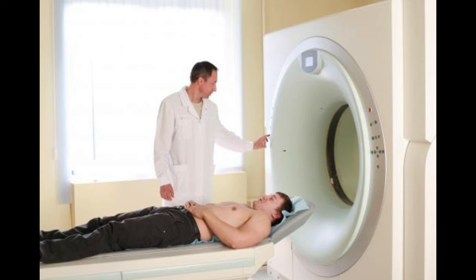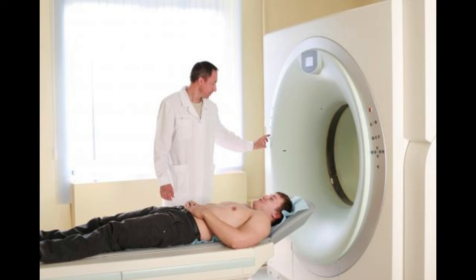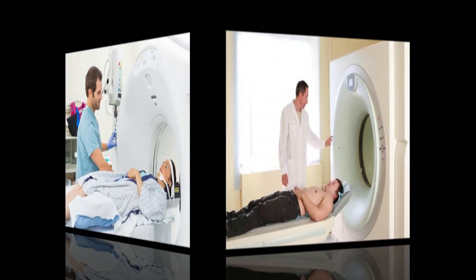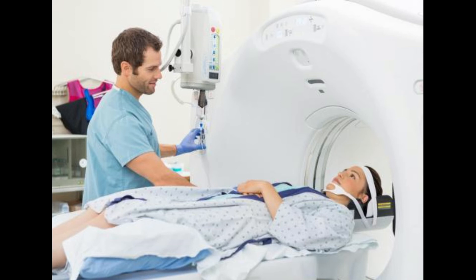These factors can include the location of the suspected cancer, the patient's history, and other imaging results. PET scan images can be combined with computed tomography, CT, images or magnetic resonance imaging, MRI, in a process called co-registration or image fusion.